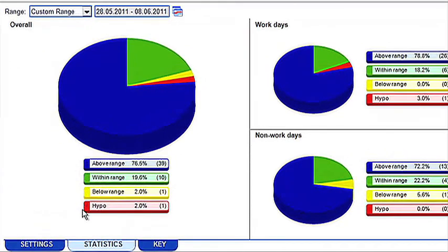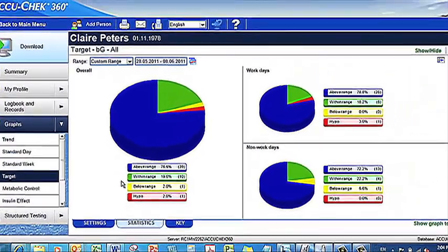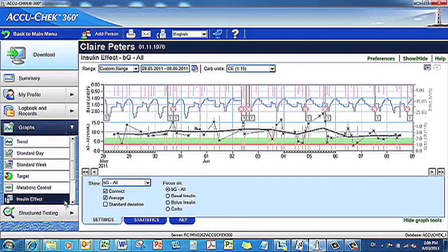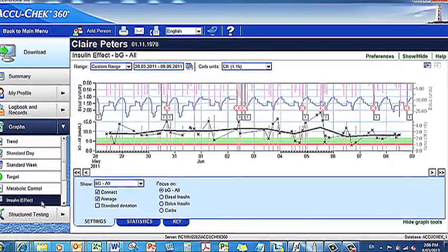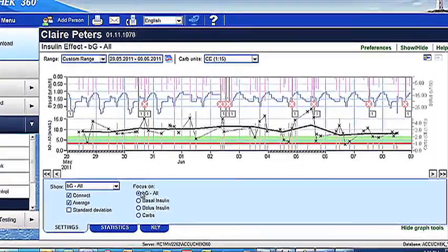The target graph also shows readings below the hypo limit. If you're using insulin to manage your diabetes, another important graph is the insulin effect graph. This graph shows the effect of insulin and carbohydrates on your daily blood glucose levels and can indicate any diet, lifestyle or medication changes that may be required to better manage your diabetes.